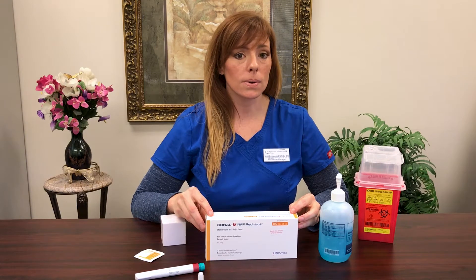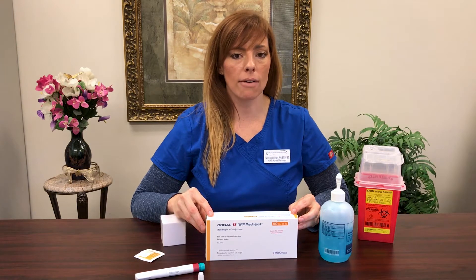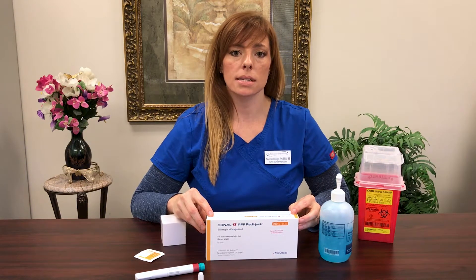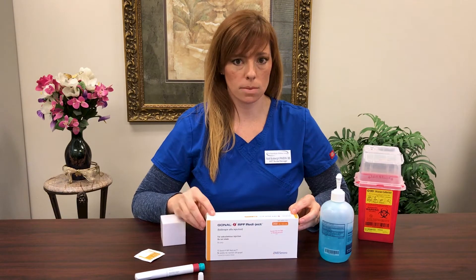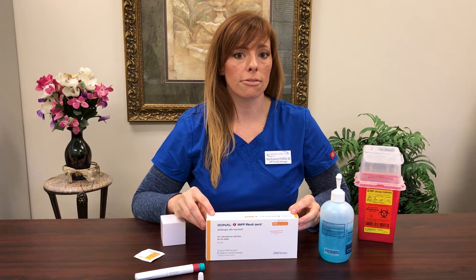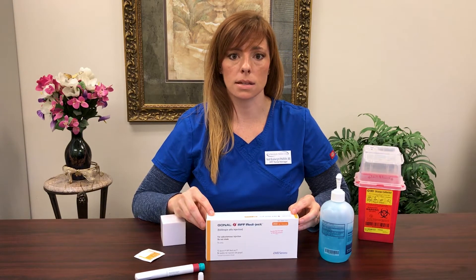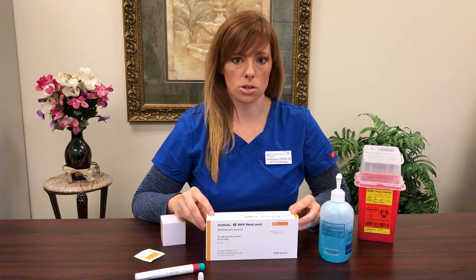Today I want to teach you how to use your Gonal F, which is also a brand name for follicle stimulating hormone. You may hear it referred to as FSH in the ART department, or see it written on your calendar as FSH as well. There is another brand name out there: Follistim. They are interchangeable, so if your pharmacy sends you Gonal F first and you receive Follistim later in the cycle, that's absolutely okay — you just need to let your nurse know so we can make a note in your chart.